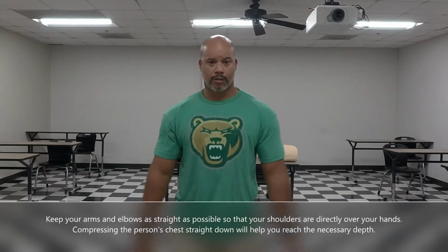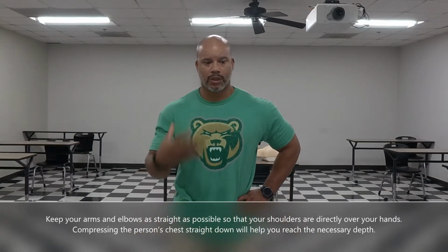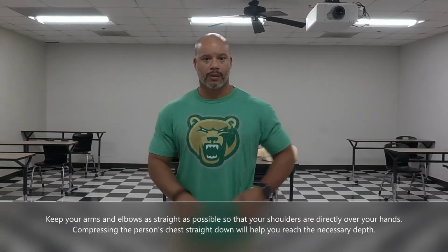Now, when you do these compressions, even though I'm moving kind of slow right now, you want to be hard and fast with it. You want to simulate the same rhythm that a heart would have, right? So when you get in that position, hard, fast motion. We'll get to it in a minute. Just something to think about beforehand.